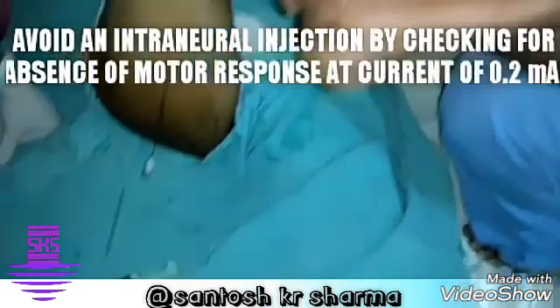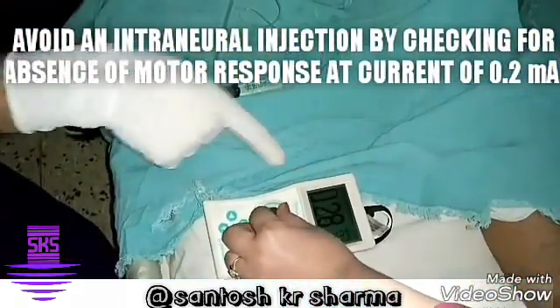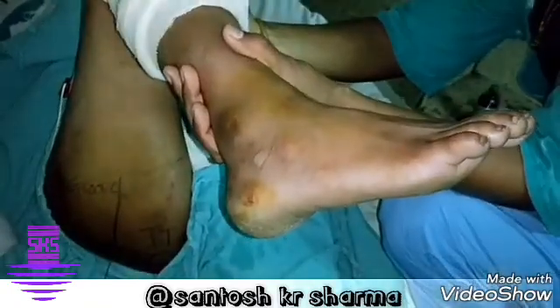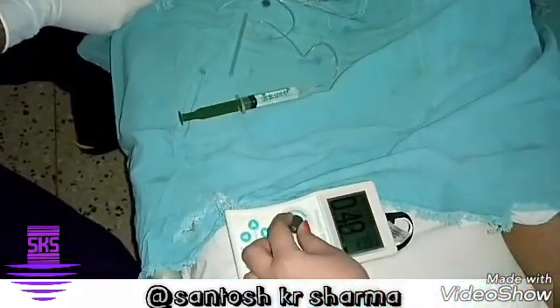Reduce to 0.20 milliamps. There is no response at 0.20 milliamps. Come back to 0.48 — and again the response is there. This confirms correct needle placement without intraneural positioning.